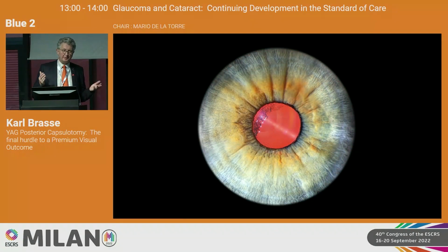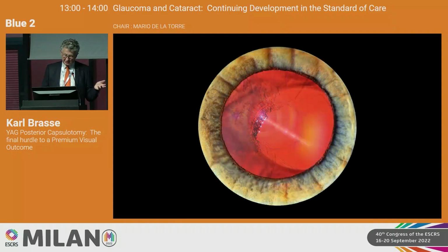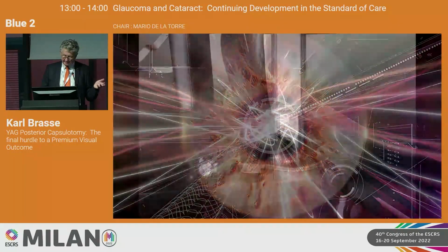If you do it primarily, I've showed you the technique. We have a new lens now with the broader diameter. The new laser has a posterior offset of 2 millimeters. And there is a group of patients that can benefit from your knowledge. I call that a reshape. I'll just go through the cases right now to save time. This is an unhappy patient. I did a reshape.